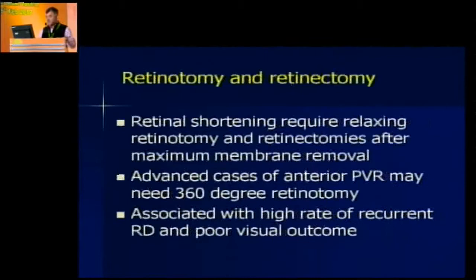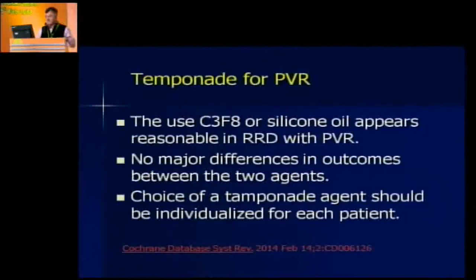And if you have a shortened retina, as I mentioned earlier, you may have to do a retinectomy or a retinotomy. And maybe sometimes, very rarely, a 360 degree one. I hate this, I think they do very badly. So most of the time, it is only once in a while that you have to do that. And for tamponade, most of the time you use either a long-acting gas or an oil in such a situation, if it is a funnel case.